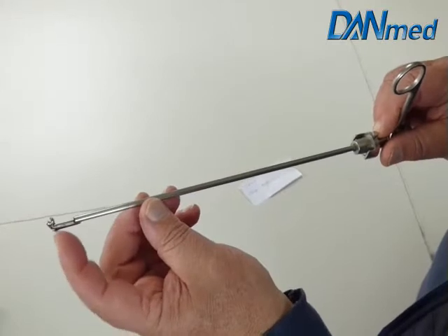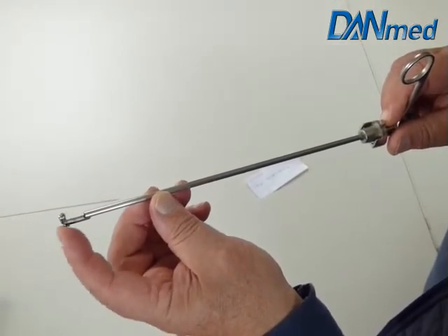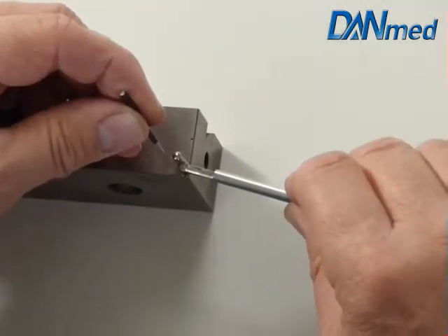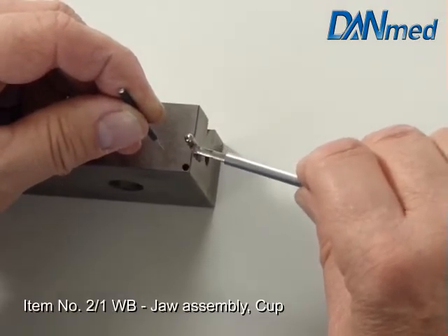This is a broken jaw of an optical forcep. The links are damaged. Now we want to change the whole insert. We want to show how to use our repair part 2-1WB.